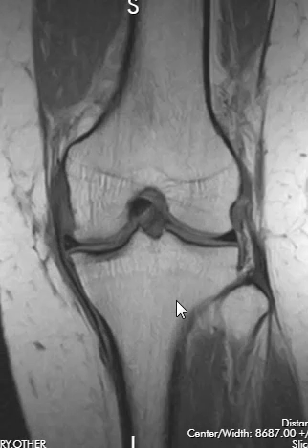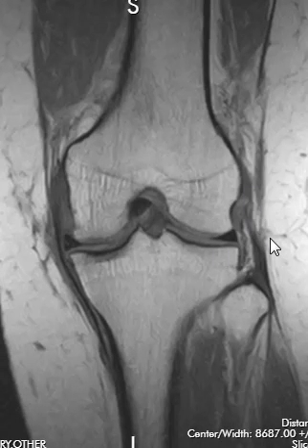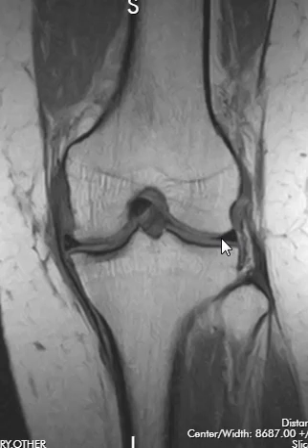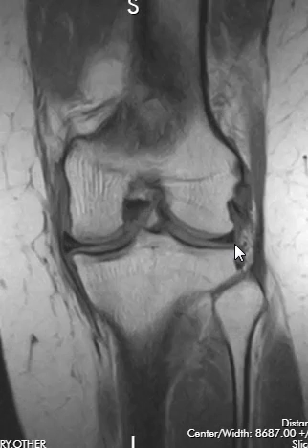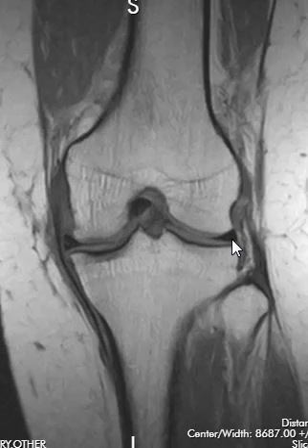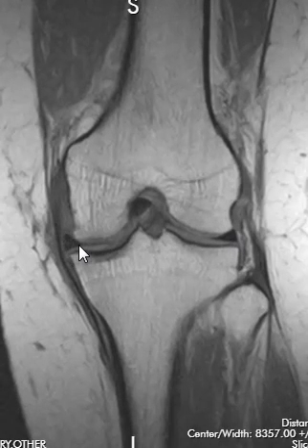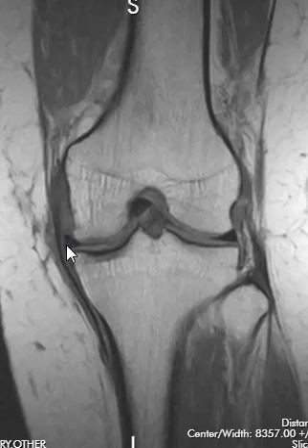Now the lateral meniscus is over here — this is the lateral side. The medial meniscus is over here. The meniscus is a little triangular wedge, and it's just wedged right between the femur, which is round, and the tibia, which is flat. This patient's lateral meniscus looks normal. The medial meniscus, though, was the problem.